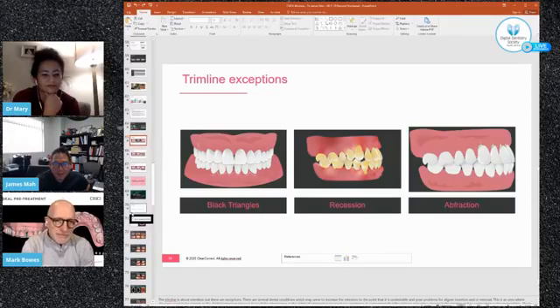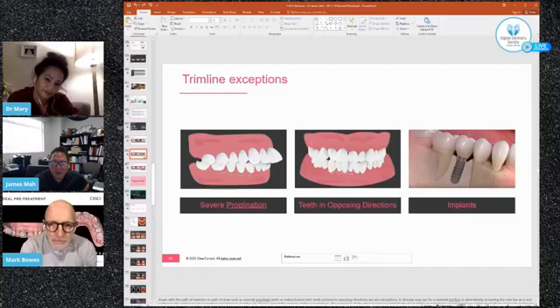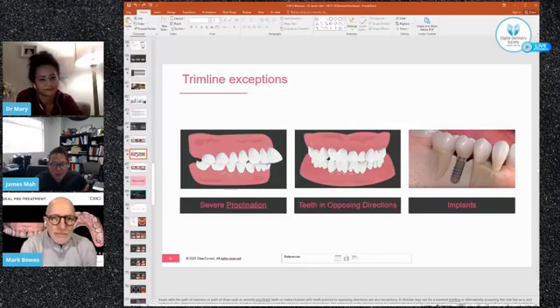Yeah. Okay. Just quickly to finish on the trim lines, you still need to look at the patient and see what they have. There are patients, and there's examples, and you can find this in ClearCorrect's literature as well. You don't want the black triangles or people that have excessive recession or abfraction. These are all the listed exceptions where you can ask ClearCorrect to back down on the trim line, because if you use extended trim line, you may have differences with path of draw and so forth, or some implant designs have extreme undercut.